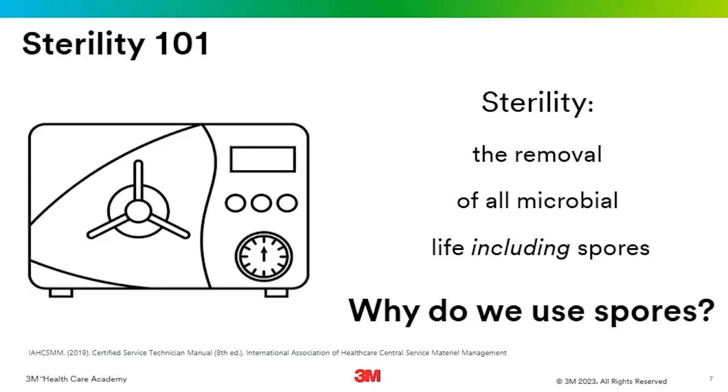But when we get to the sterile aspect of sterile processing, this is the end of the line. The moment that those instruments go into that type of steam or chemical sterilizer, that's it. That's the last time we're going to see our instrument sets before they're being used on a patient. That's why every step leading up to the sterilizers is equally important.